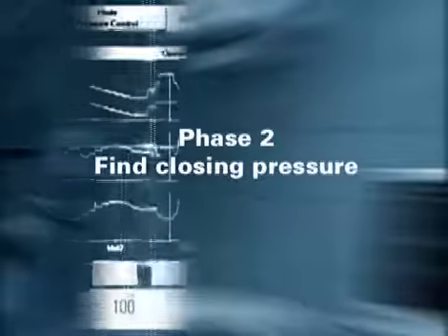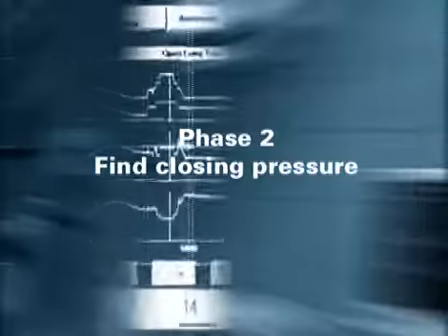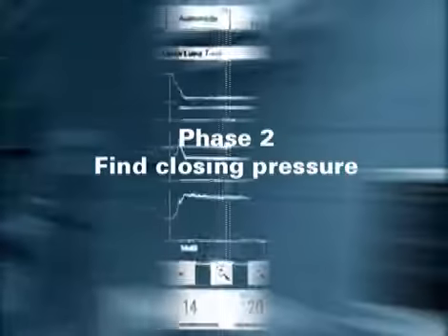In this important phase of the recruitment strategy, the level of PEEP that prevents end expiratory collapse of the recruited lung is determined. This is done by a decremental PEEP trial in which PEEP is stepwise reduced. The corresponding changes in dynamic compliance during this reduction are closely monitored. A constant pressure gradient of 18 centimeters of water is maintained in this case.